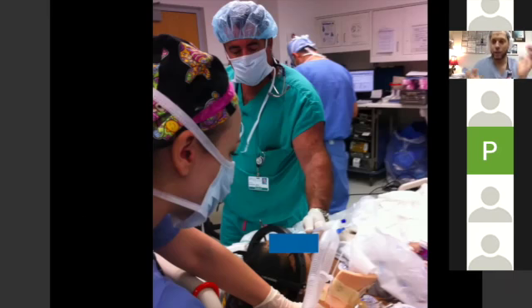So basically, what is inline stabilization? One of your peers holds the occiput like this. It's not traction, that's been disproven. It's just holding it in place. You're basically countering the forces that the laryngoscopist is doing. So as they lift, which they try not to do in this case, the other person is just holding the head still. And maybe you want to consider not doing cricoid, right? Because if you have an unstable spine and you push down on the cricoid cartilage, you might push the spine into the spinal cord. So sometimes that can be dangerous.